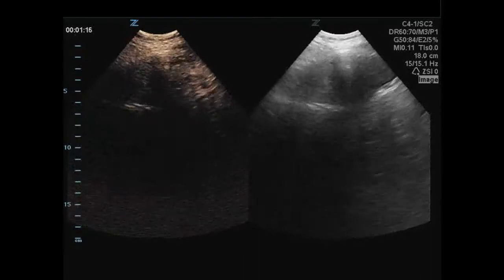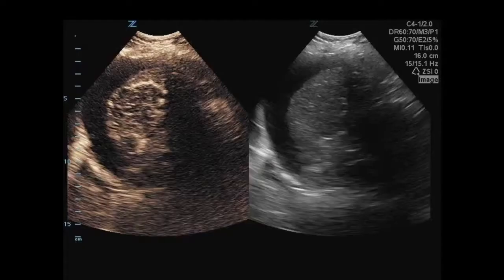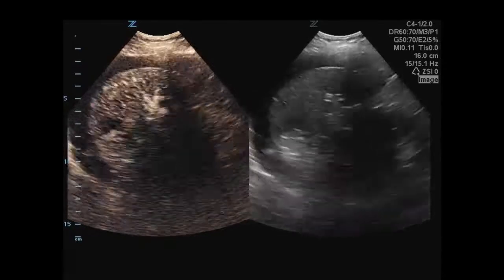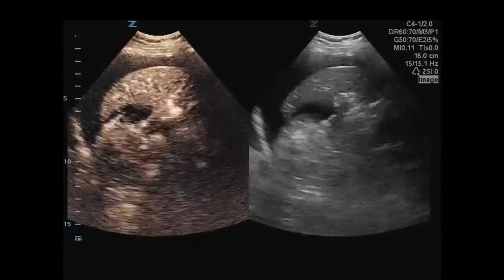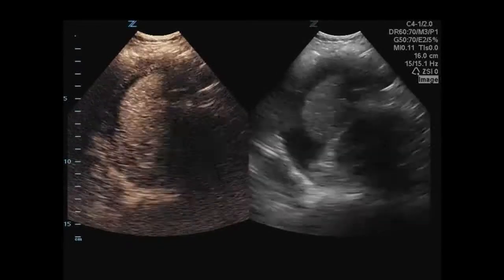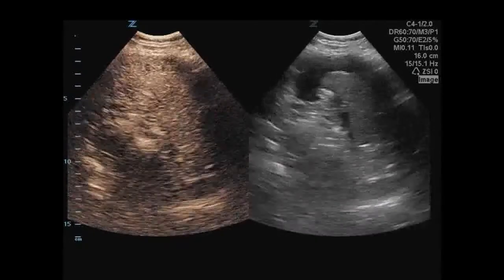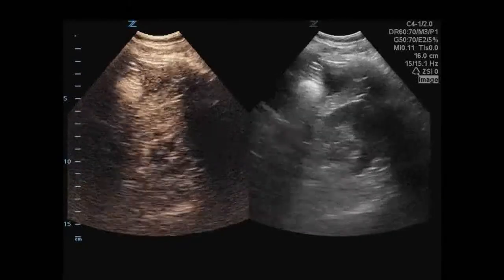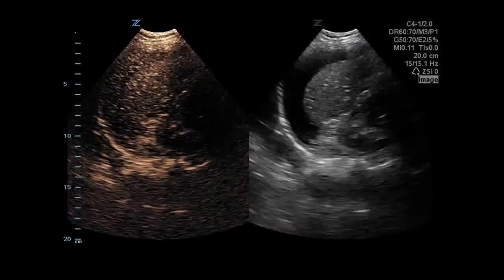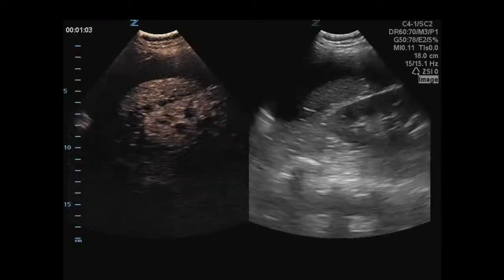And then I'm just going to speed ahead real quick. You can detect active bleeding. This is a patient who unfortunately had a lot of free fluid. And then you can see the contrast bubbles leaking out into the free fluid around the spleen. You can see a lot of contrast in there. So you can see that there's still active bleeding going on. Not encouraging, since he got CPR and TPA for his big PE. But then after the TPA wore off, you can see that now no longer is there any active bleeding. So that sort of helped triage what we were going to do for him and do his splenectomy before we fully heparinized him for his massive PE.